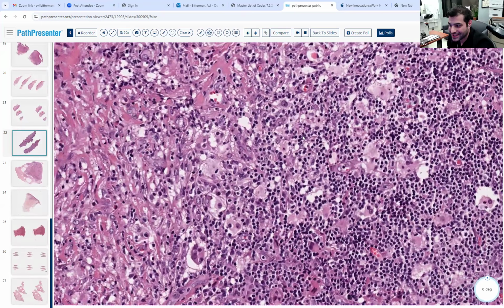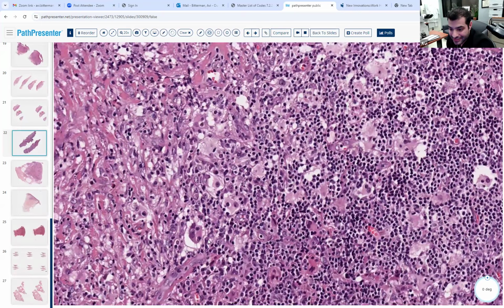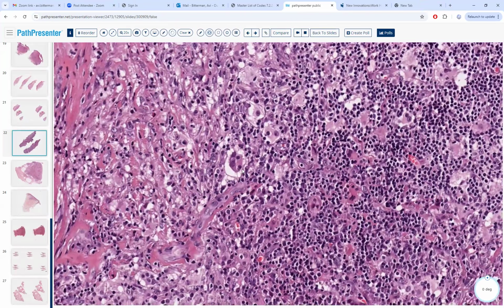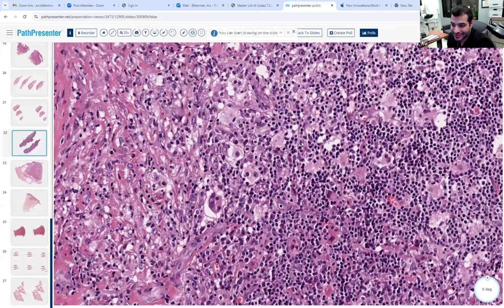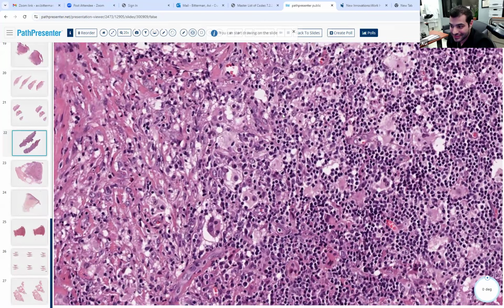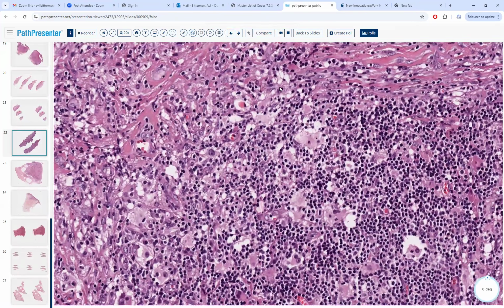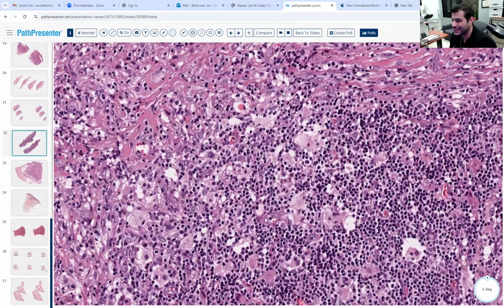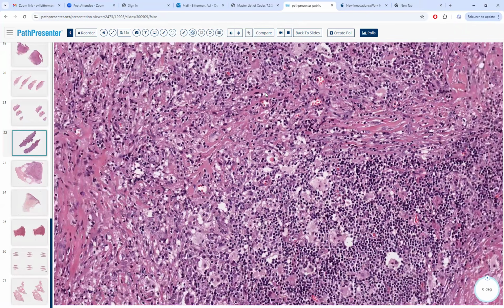So what's off about these histiocytes? They have intact cells inside of them. Yeah, there's intact cells, and in this histiocyte there is a plasma cell inside here, just chilling. So that's emperipolesis. Oh, Rosai-Dorfman.